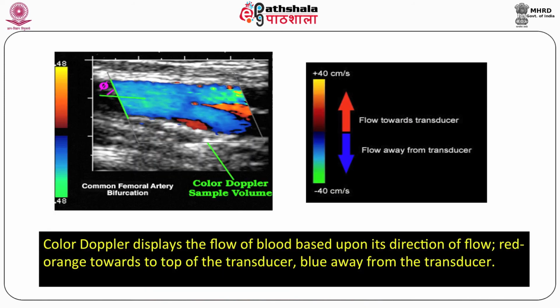Color flow imaging requires that the ultrasound beam remains stationary at one point for a brief period of time before moving to the next line and so on. The electronic transducer may steer the beam. Color Doppler presents a real-time image of both anatomy and a picture of blood flow, and gives the Doppler information.